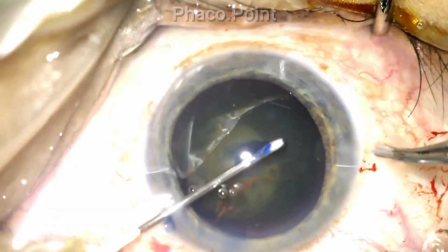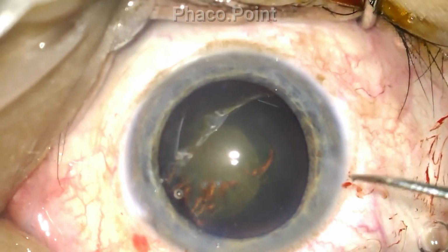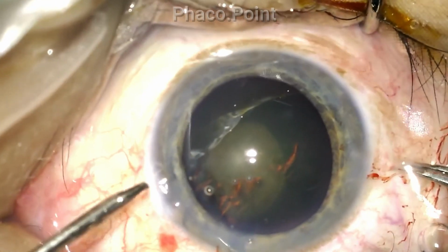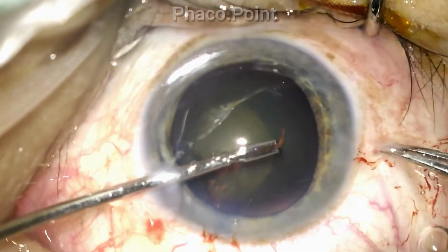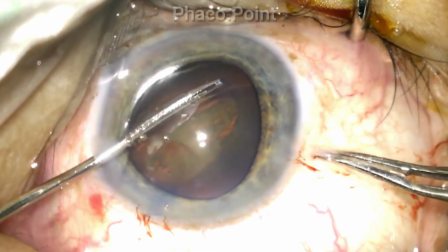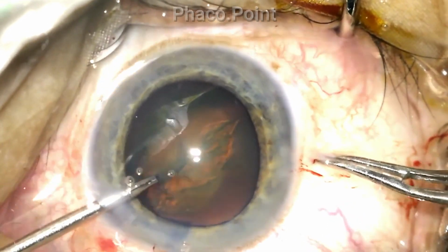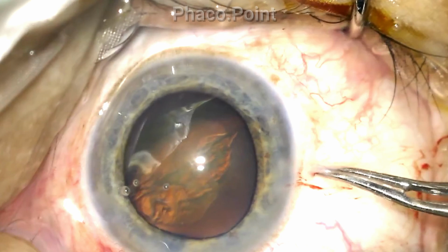A nick is made in the capsulorrhexis in the area where it needs to be enlarged. The tear thus created is now held with the help of an intraocular forceps, and as you can see, the rhexis is now enlarged. The resultant capsulorrhexis is now not only stable, but it is adequately sized to allow for a very comfortable subsequent phacoemulsification.